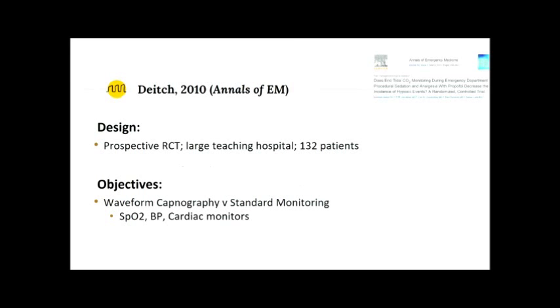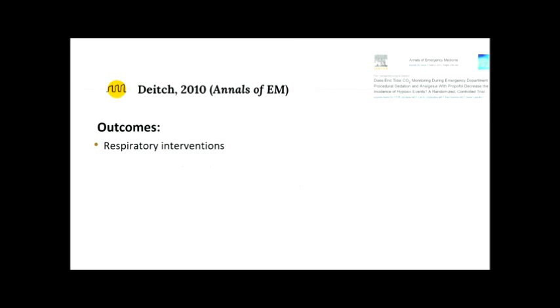And what they were looking at is, does waveform capnography, compared to what we have as our standard monitors, which includes oxygen saturation, blood pressure monitoring, and traditional cardiac monitors, how do they compare to one another? And their objectives were looking at respiratory interventions, which they included to have verbal stimulation, physical stimulation, bag mask ventilation, or endotracheal intubation.